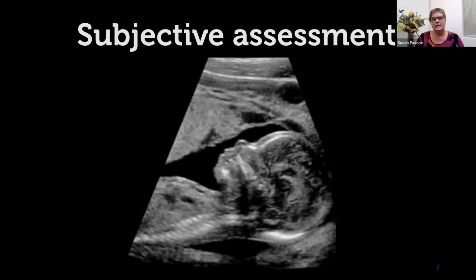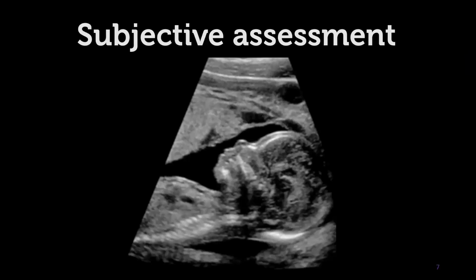And you can take a clinical history from your patient. But on those patients of a normal body habitus, obviously when you have larger ladies, they can often be hard to assess regardless of what we're doing. But the amniotic fluid, the sound interacts well with the fluid and passes through the fluid well. So if there's enough amniotic fluid around the baby, there is enough of a window to be able to see the detail of the fetal anatomy.